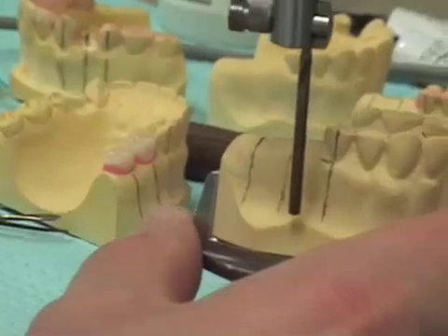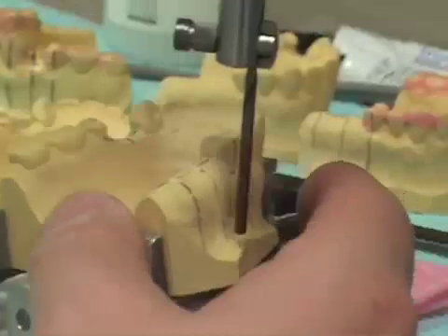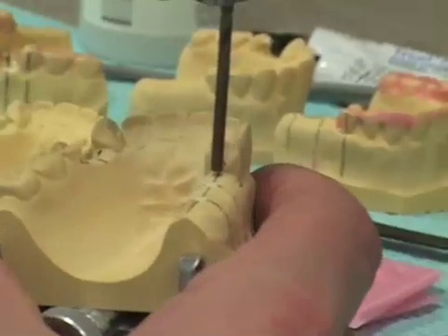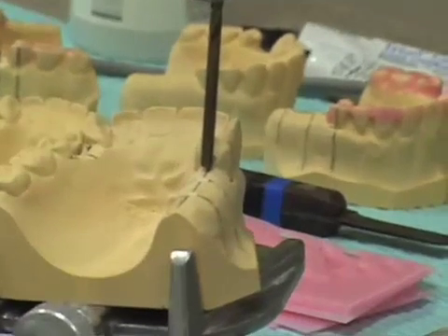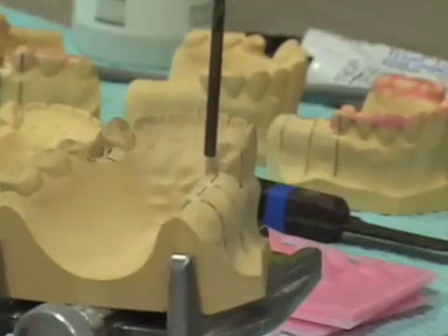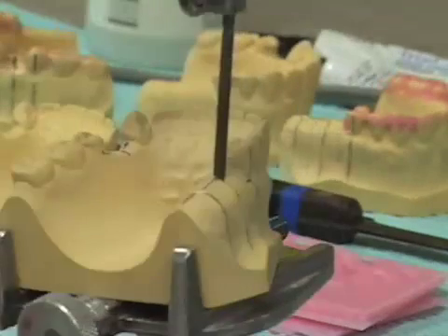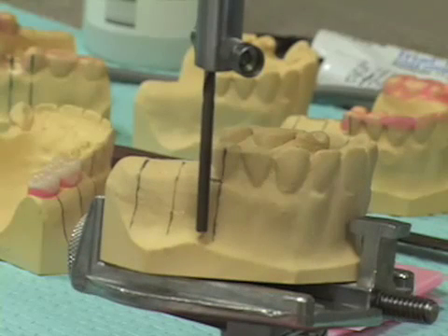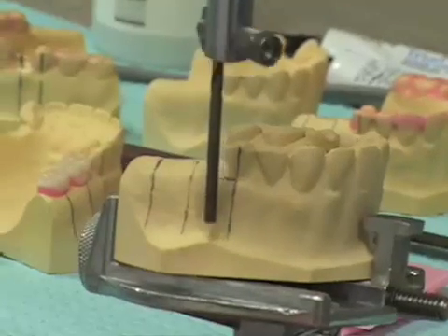I'm going to line this up mesiodistally and also in the buccal-lingual orientation. When I look at the distal-proximal of the tooth adjacent to where our implants will be placed, I see that I'm lined up on the center of the proximal, and I don't have any large soft tissue undercuts that would cause a potential dehiscence of my implant as it went further in. We're lined up nicely, paralleling the root of the tooth on the anterior aspect of our edentulous space, and we'll now block this cast out.